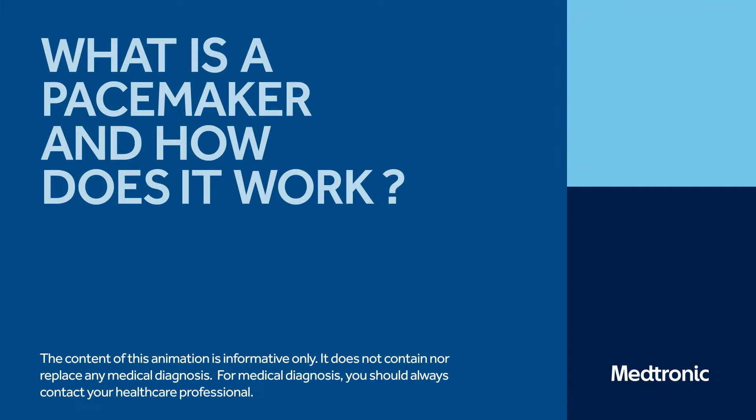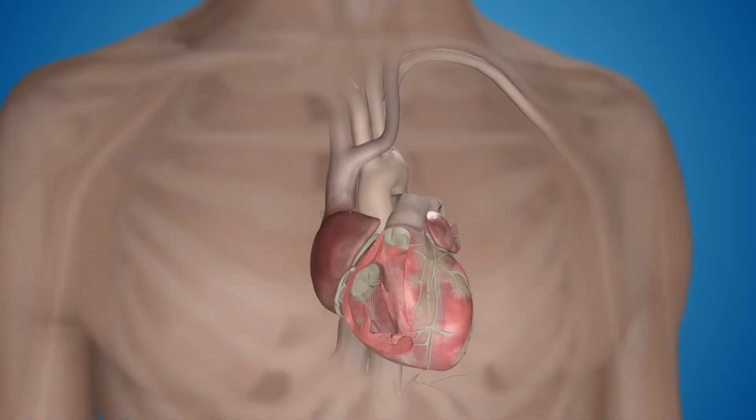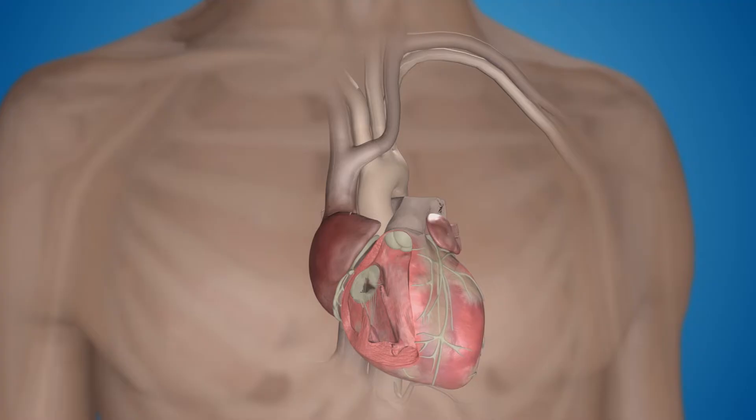What is a pacemaker, and how does it work? When the heart's natural pacemaker is not working properly, the heart may beat too fast, too slow, or irregularly. A doctor may implant a heart rhythm device, like a pacemaker, to restore the heart's natural rhythm.